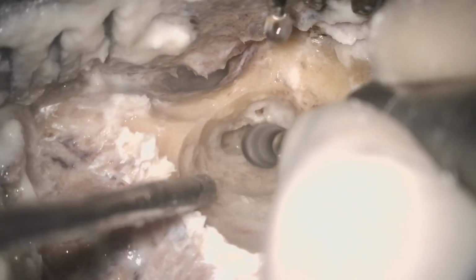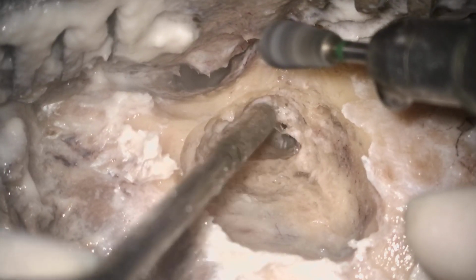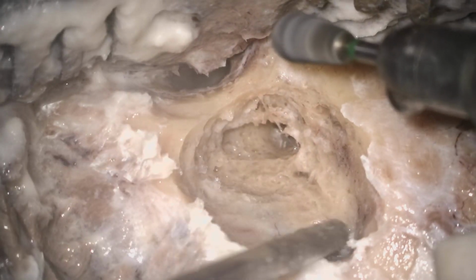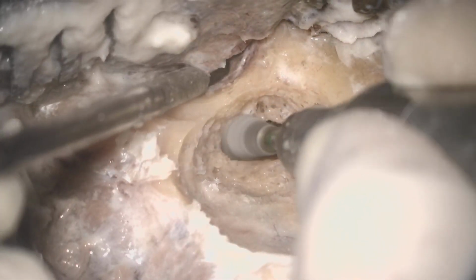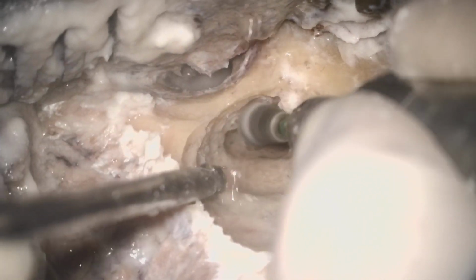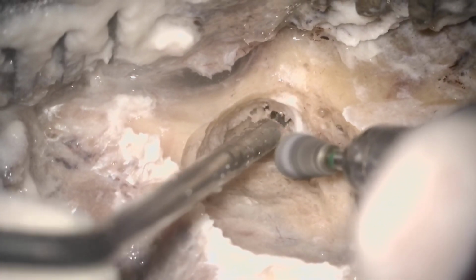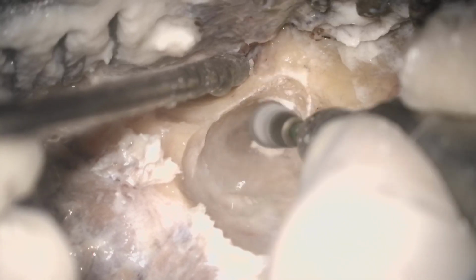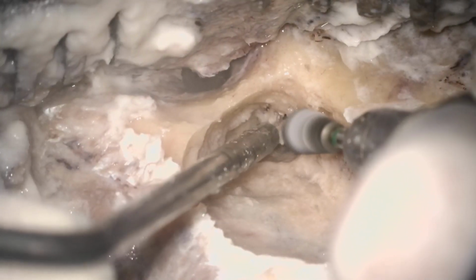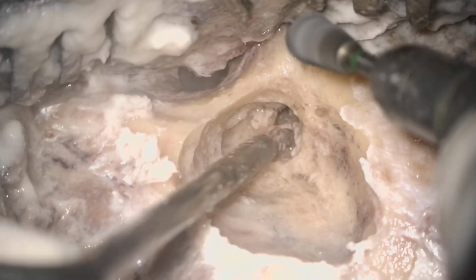So this is how you should go for a cortical mastoidectomy. Don't directly jump into the mastoid cavity or do a bur hole. First delineate the landmarks superiorly, posteriorly, the sinodural angle, and then slightly go into the anterior part to delineate the canal wall and make it as thin as possible, but don't destroy the canal wall. This is a very common mistake in cortical mastoidectomy, because if you damage the canal wall, then the whole thing is damaged, because it is a canal wall up surgery.